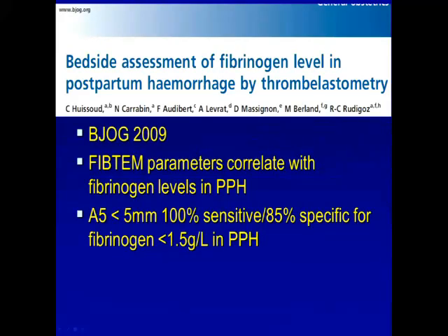Yeah. Also calibrating the machine 2-3 times a day. It's calibrated once a day. At the General, they're calibrating once a week. It's a bit of a bun fight right now with our lab. I'm meeting with everyone else this afternoon on a number of topics. This is one of them. But that's been a bit of a challenge in the morning during the busy setup time for Hearts, getting that machine calibrated. But once it's calibrated in the morning, you're fine until next morning. So if you have a 3 a.m. test, all you have to do is turn the machine on.